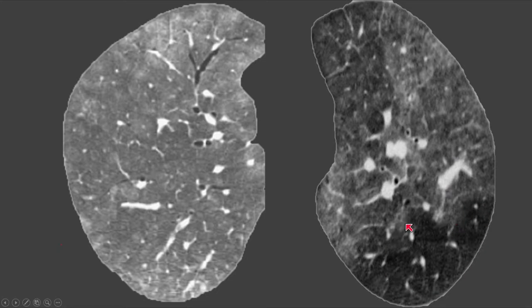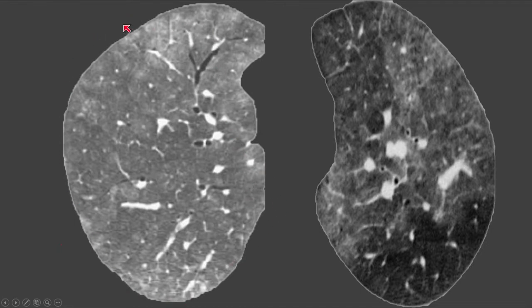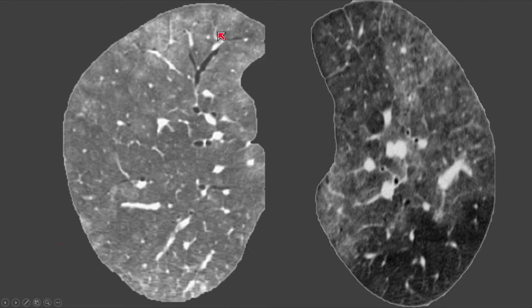The lucent lung is abnormal, and the dense lung — even though it looks abnormally dense — is actually normal lung parenchyma with large arteries inside it. The abnormal lung appears hyperlucent with smaller vessels. In a second case of mosaic attenuation with heterogeneous lung density, the vessels are generally even in size and distribution throughout, implying a ground glass abnormality. This contrasts with the mosaic perfusion case.